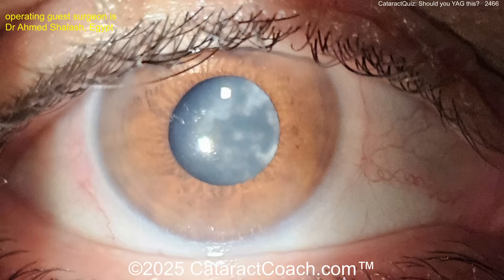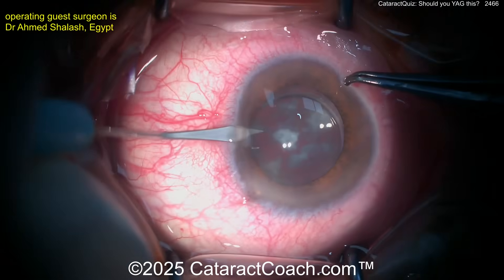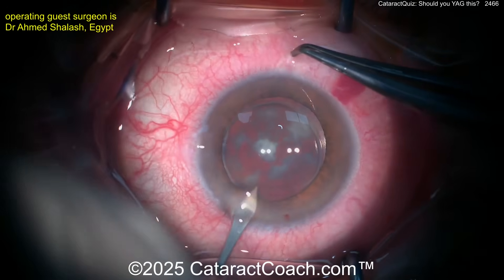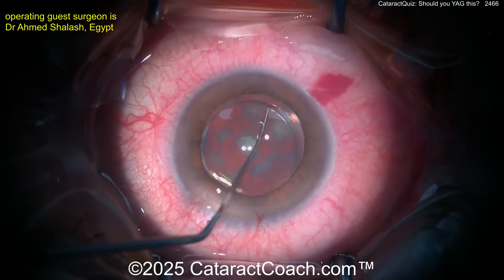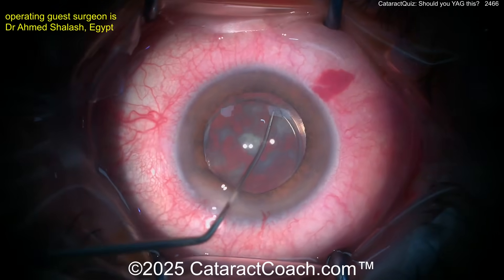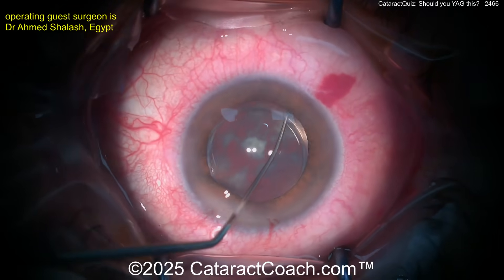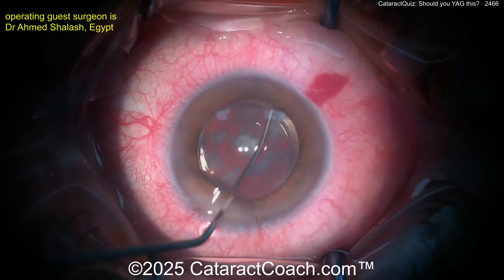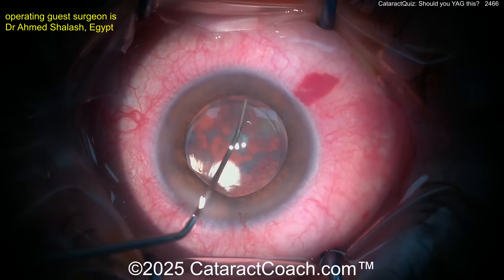Think about that — what should we do here? Our guest surgeon says no, let's go back to the operating room. In the OR, trying to see if you can wash away some of this material — making a couple of paracenteses. Let's see: lift up the lens. I like this idea — try to carefully dissect the lens from the capsular bag.